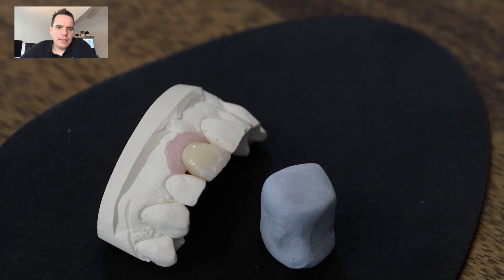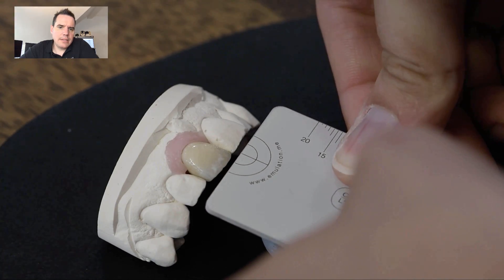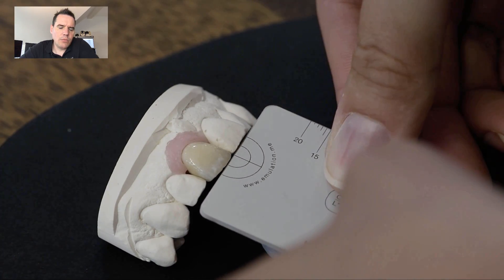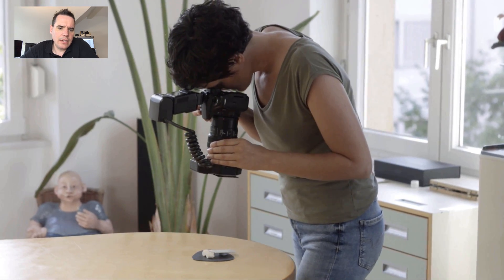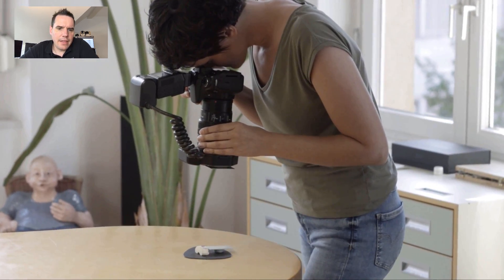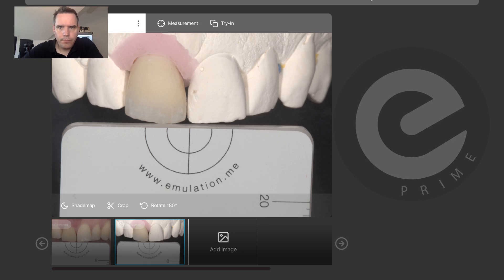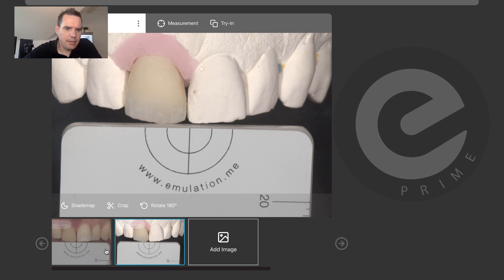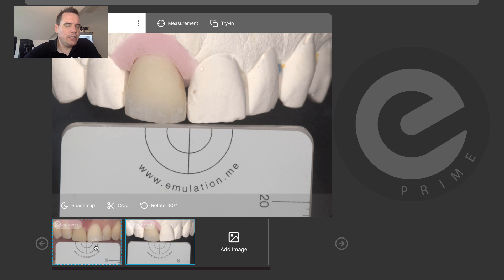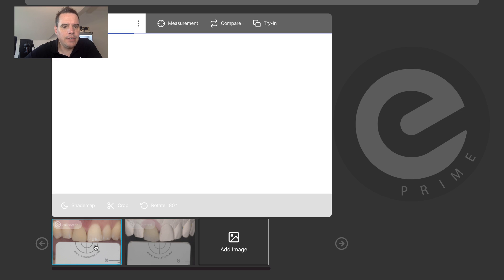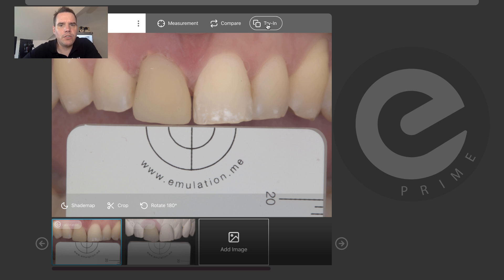Then you need to take a photo after you've trimmed it, and you place the crown on the simulation model. There is more information available on what that is on our webpage as well. Then you take a photo and you're ready to go to the next step with Prime. This image is already imported into Prime, and one of the coolest things you can do with Prime is a digital try-in. In order to do that, you have to first select the clinical image — the one you used for measuring the target — and then simply click on try-in.